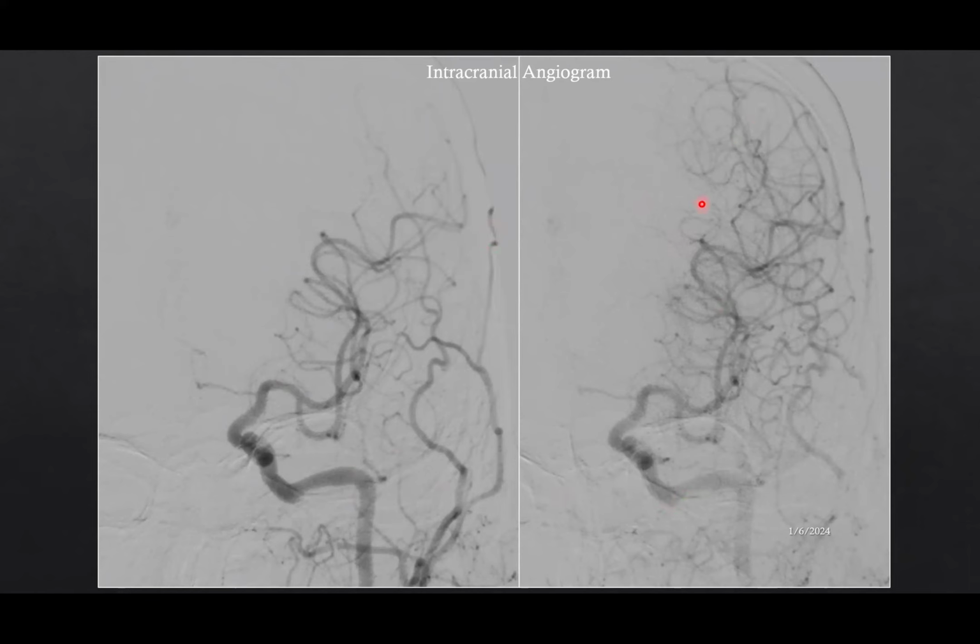The stenotic segment was crossed with the filter wire. The filter which I used here was an EmboShield NAV6. It was crossed distally and placed in a safe place. This is the angiogram after the filter placement. I did a preplasty of the stenotic segment prior to the placement of the stent, using a 3 by 12 mm coronary balloon.